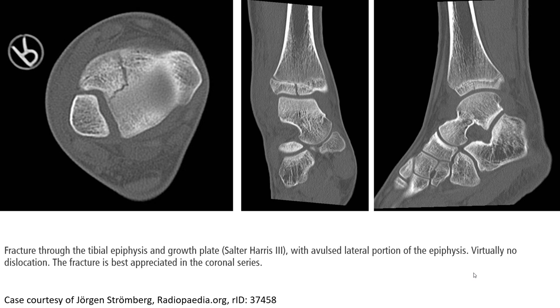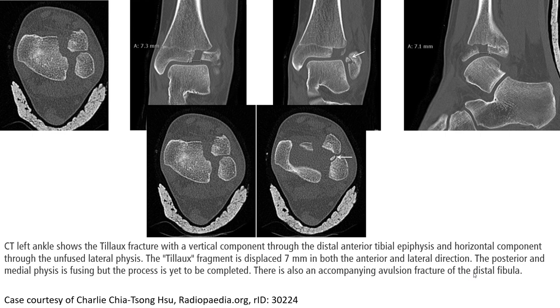Another example of a Tillaux fracture on CT scan shows the fracture through the tibia epiphysis and growth plate, Salter-Harris type 3, with a wide lateral portion of the epiphysis. Visually, no dislocation is seen and the fracture is best appreciated in the coronal series. The CT coronal view shows the Tillaux fracture with a vertical component through the distal anterior tibia epiphysis and a horizontal component through the anterolateral epiphysis, with displacement of a millimeter in both anterior and lateral direction.